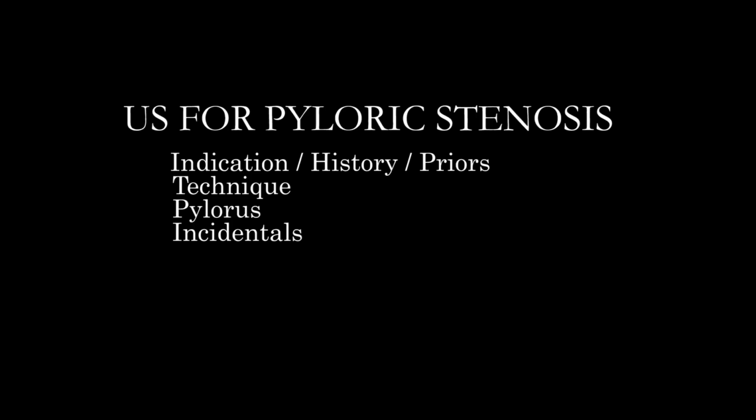Okay, so just as a review, big picture, what are we doing when we do an ultrasound for pyloric stenosis? You want to understand the patient, understand the nature of their vomiting. Textbook, do they fit the typical, suspicious demographics of between 3 weeks and 3 months, male patients, et cetera. And then we're going to troubleshoot and try to find that pylorus, scanning in the epigastrium, looking near the gallbladder, and then doing a little bit of feeding if we need to, and reassuring the patient.